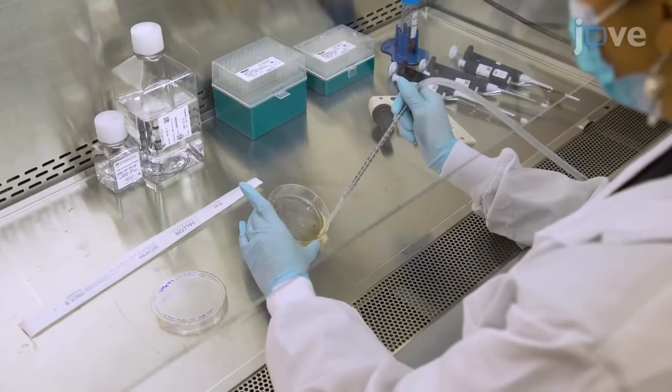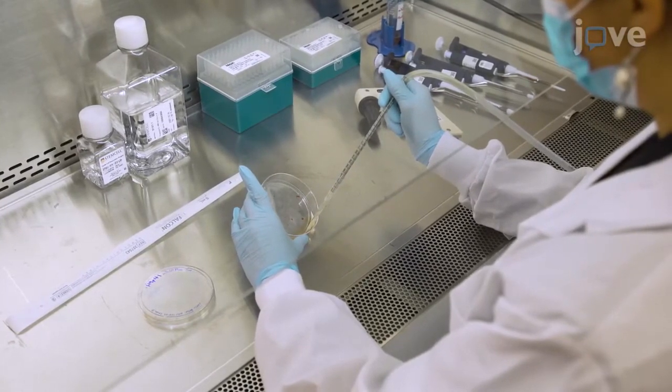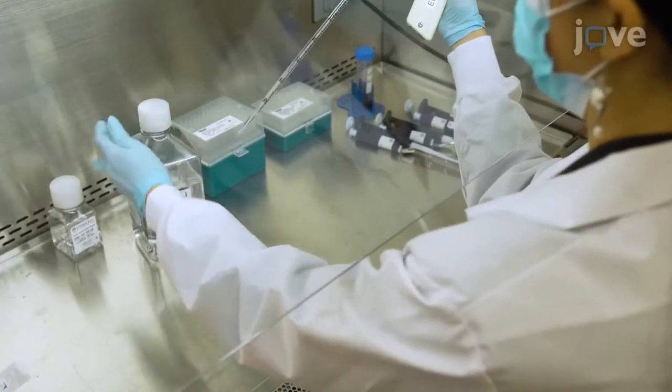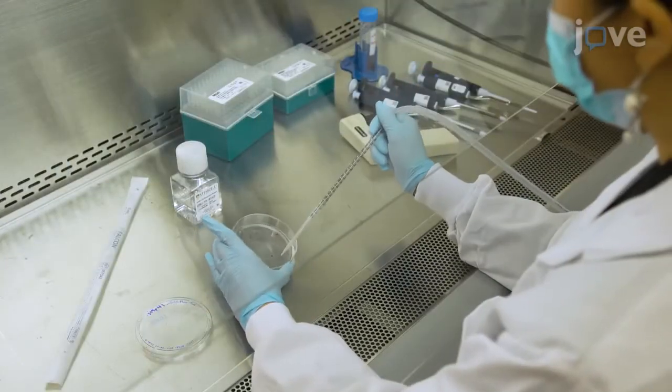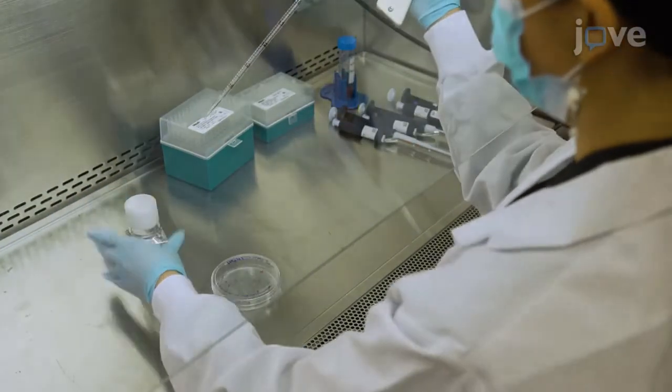When cell confluency reaches 70 to 80%, aspirate the spent medium from the culture dish and wash each culture dish with 5 milliliters of DPBS without calcium or magnesium at room temperature. Aspirate the DPBS wash from the culture dish, then add 5 milliliters of enzyme-free dissociation reagent to the dish.